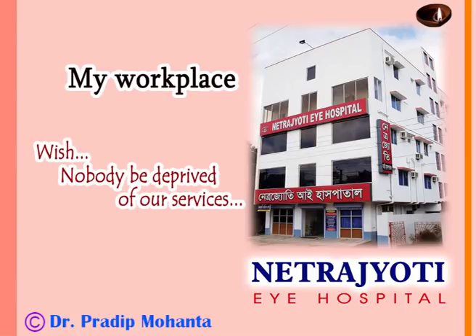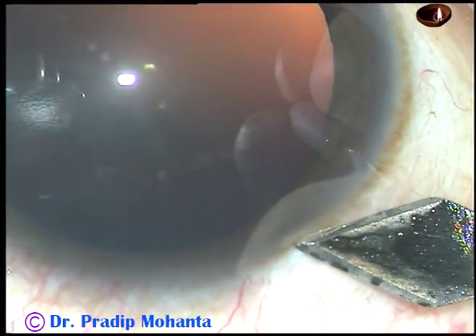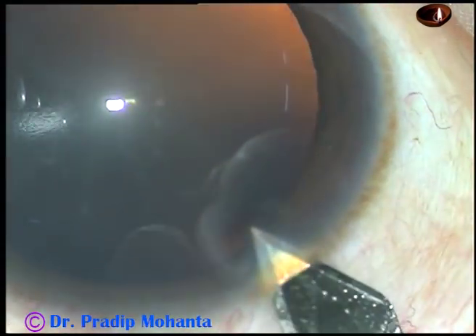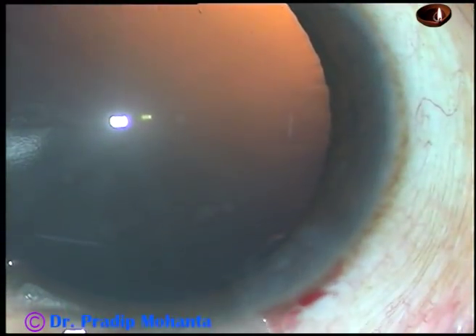Friends, welcome to my hospital at Ranaghat, India. In this video, I want to show clear lens extraction with intraocular lens implantation. The patient is a 40-year-old lady with minus 12 diopters of myopia.